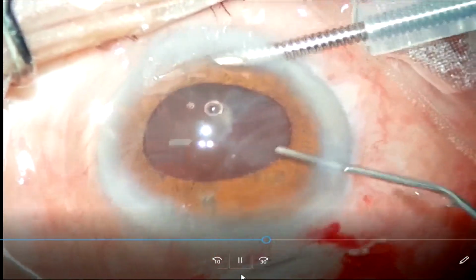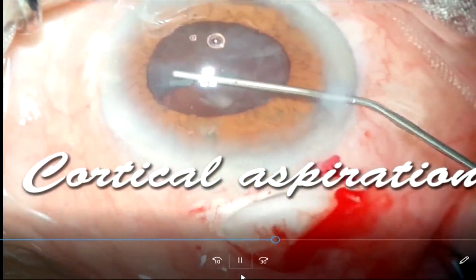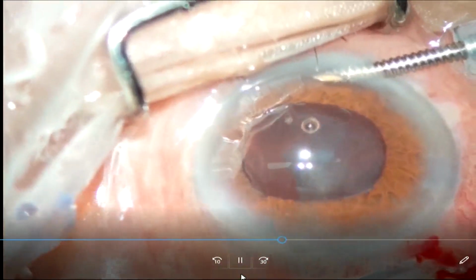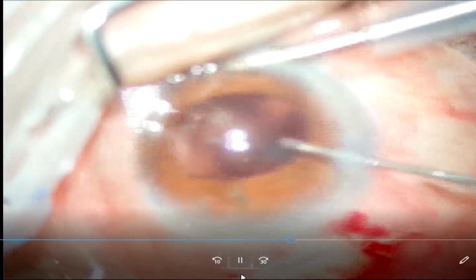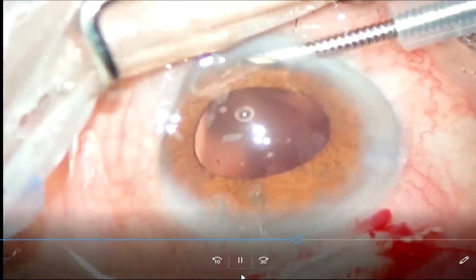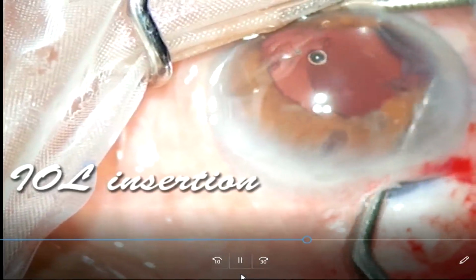Now once the nucleus is out, I don't use a Simcoe cannula, I just use the same cannula you use for hyvis, through the side port with the anterior chamber maintainer on, and aspirate the cortex. This is especially useful for aspirating the 12 o'clock cortex. You can see how easily, without any injury to the posterior capsule, you can go quite behind. And there is no chance of collapse of the chamber.